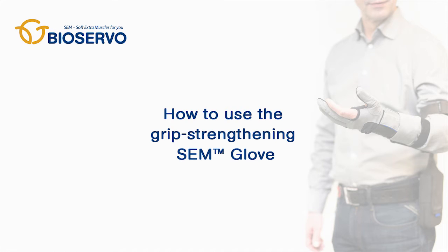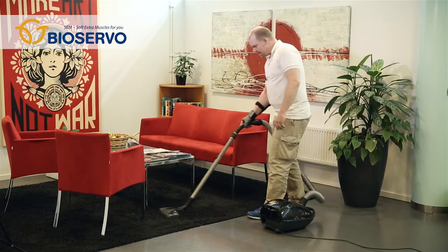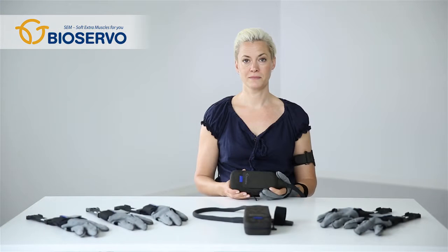How to use the grip strengthening SEM glove. The SEM glove is a user-friendly grip strengthening aid that can be used at work as well as in daily life. It mimics the human anatomy, strengthens the grip and either compensates where power is lacking or adds extra force and endurance.